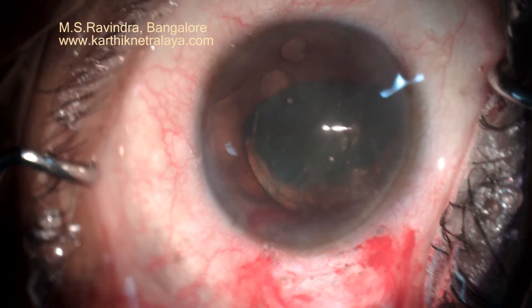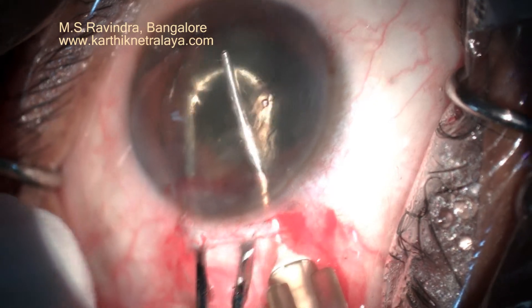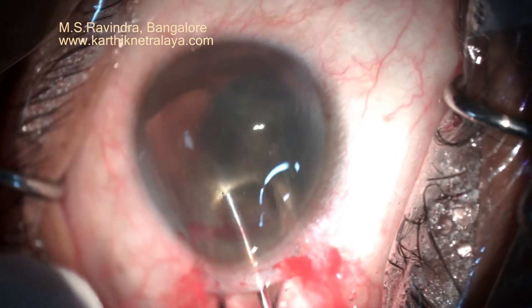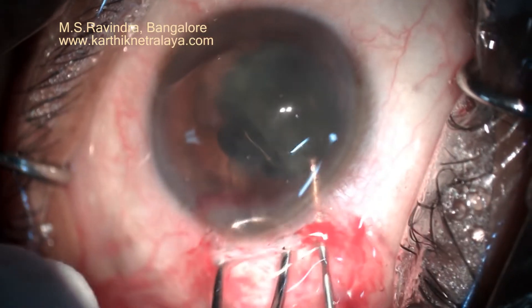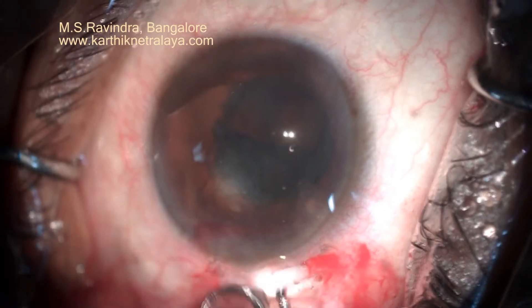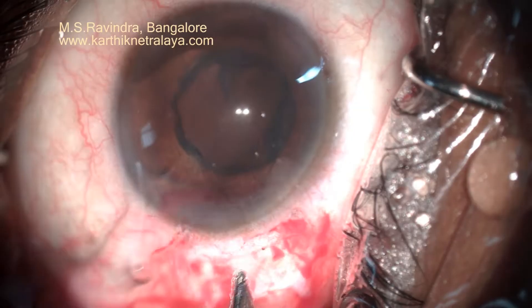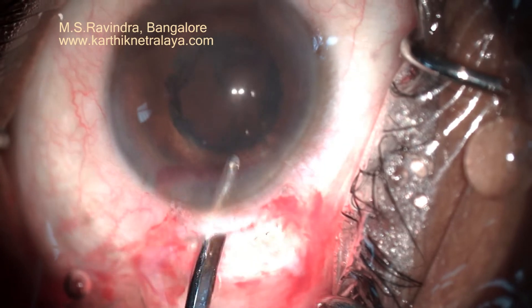The surgery is being done under topical anesthesia, and I have infused a small amount of 1% lignocaine into the anterior chamber initially, under endothelial protection of viscoelastic. Now the nucleus is removed from the anterior chamber.